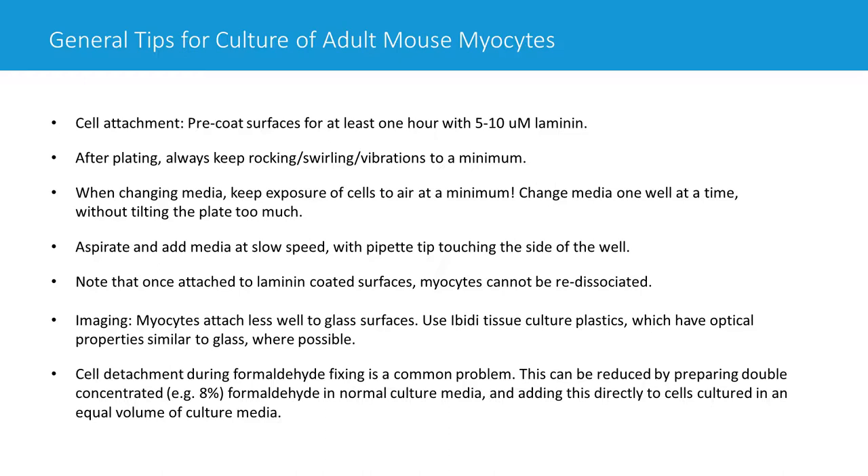While changing media, try not to tilt the plate too much. When tilted, the uppermost region of each well is exposed to air. By the time you've gone through all your wells, that top region has been exposed so much that all your myocytes have died or dislodged. Also, if using a vacuum-assisted aspirator, turn it down so it's not aspirating too fast — fast flow can dislodge cells. Aspiration should be relatively slow, and media should be added slowly back to the well by touching the pipette tip to the side of the well, so media isn't blown directly onto the cells.